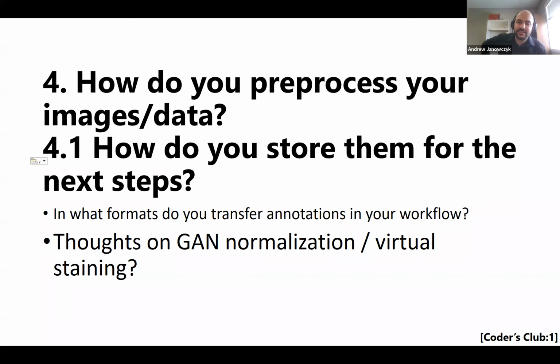My second concern is in regards to understanding what the impact of using that is on the data itself. I can imagine, and we've put out a paper that's under review now, that you start to impart biases from the training data onto the testing data. One of the concerns is that if you're using, let's say, handcrafted features and you want to extract nuclear texture, am I 100% guaranteed that applying that GAN normalization is not going to negatively affect that texture feature?